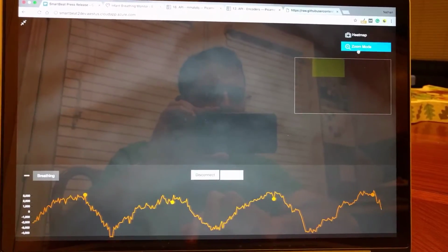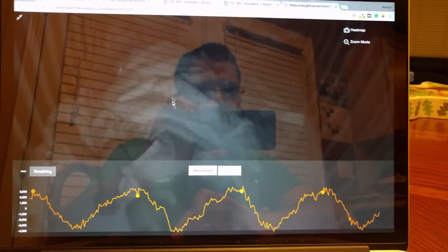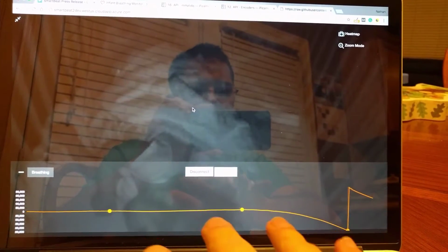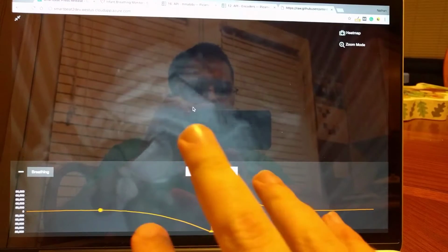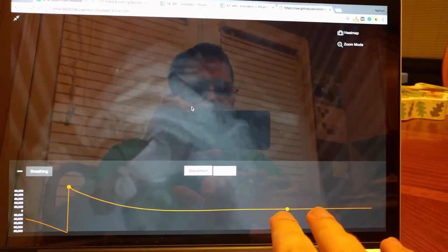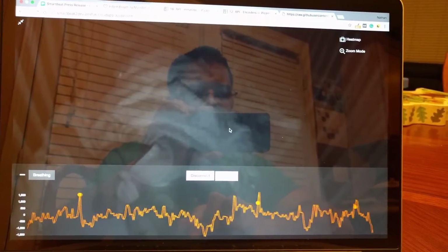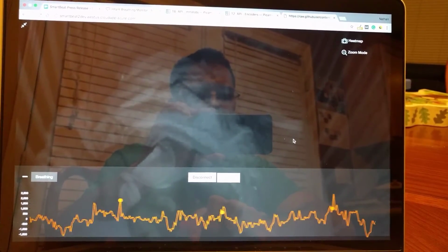Alright, I'll zoom back out. Kind of see we were like right over here, I think. And there you have it. So usually, for the most part, it should just be able to locate and check the breathing. But if you're not sure the results are working very well, then just tap on the part of the image where their stomach is, and then it's going to start tracking the breathing.